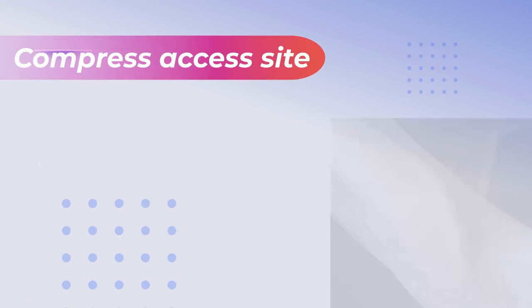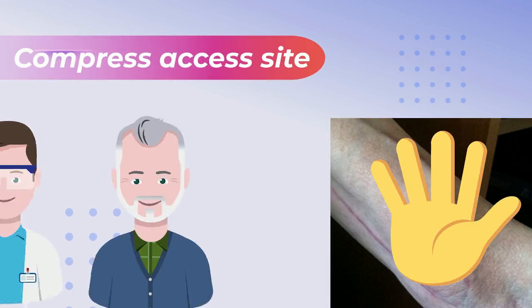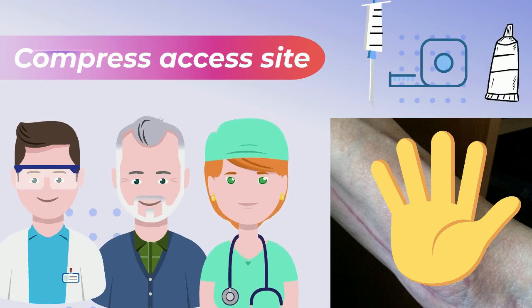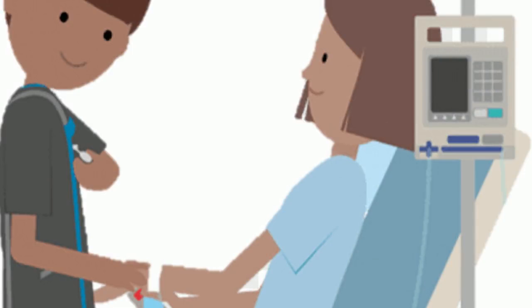They are encouraged to compress the access site at the end of treatment. Getting the patients involved in small tasks every day, including holding and feeling needles, taping the needles, and applying local analgesic helps move the process to autonomy quicker. The home therapy nurse helps model cannulation by hand-holding approach.